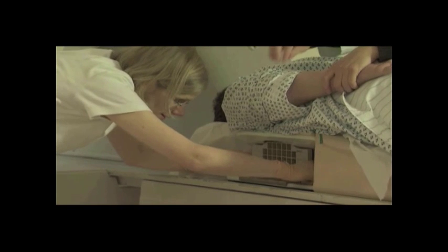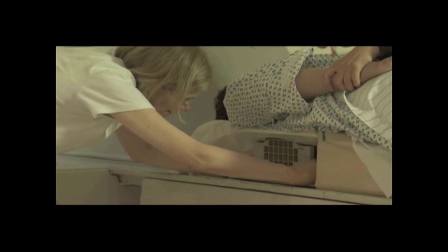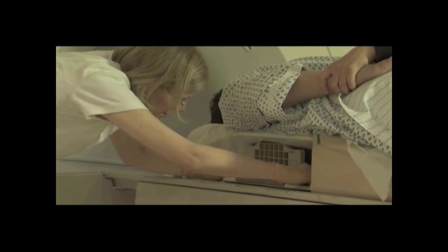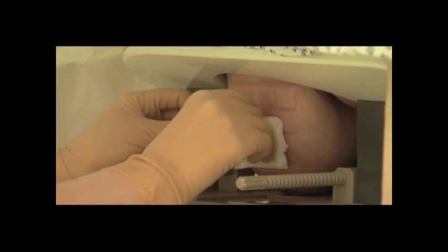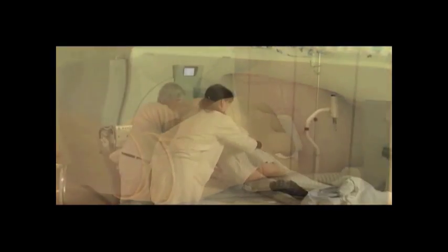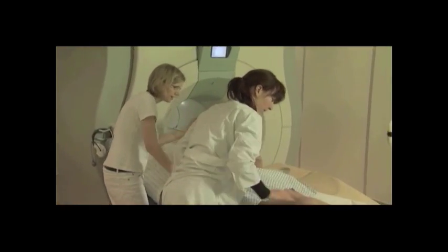Gently remove the introducer sheath from the breast and grid. Slowly decompress the breast and remove the compression grid. Immediately apply pressure to the biopsy site and when ready, assist the patient out of the coil.